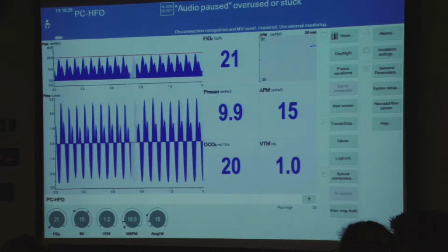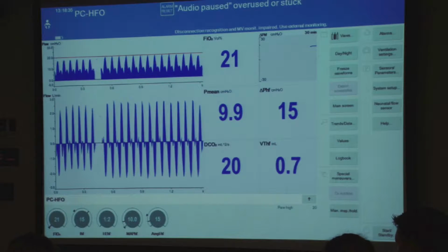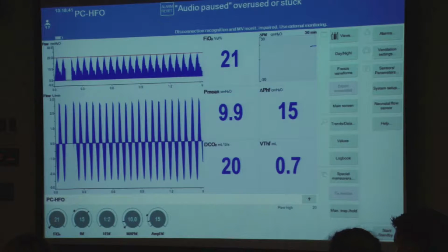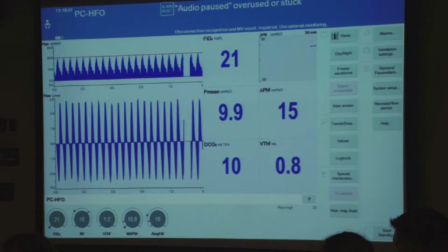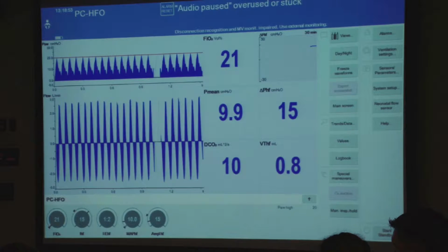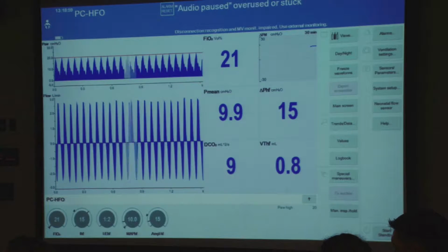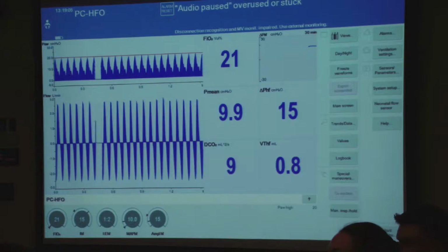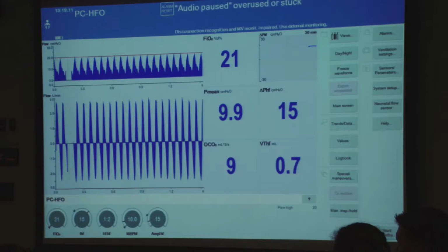and the IE ratio, which is the typical one you would see as 0.3 in a Sensormedics. With the protocol you're about to start, you're not allowed to play with this. We do, and I'll show you why, with the bigger babies, but you're only going to ventilate premature babies. Okay, so we can choose a mean airway pressure, and let's say the baby was on 8. You're supposed to go with a high volume strategy, a couple of centimeters above that. So let's put 10. And what amplitude would you choose in a Sensormedics to start with?